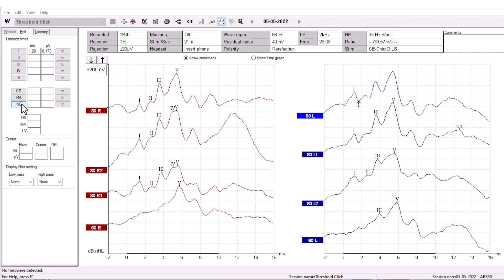You can use the CR, RA, and INC labels to label whether a waveform is clear response, response absent, or inconclusive.